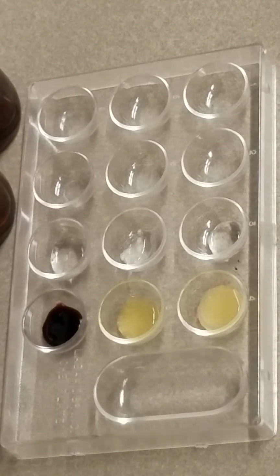You notice I get a reaction with the anti-B. That's expected. Now, since I have B negative blood, I should not get a reaction with the RH, and I don't. So because I only got a reaction in the second well with the anti-B, this tells me in fact that this is B negative blood.